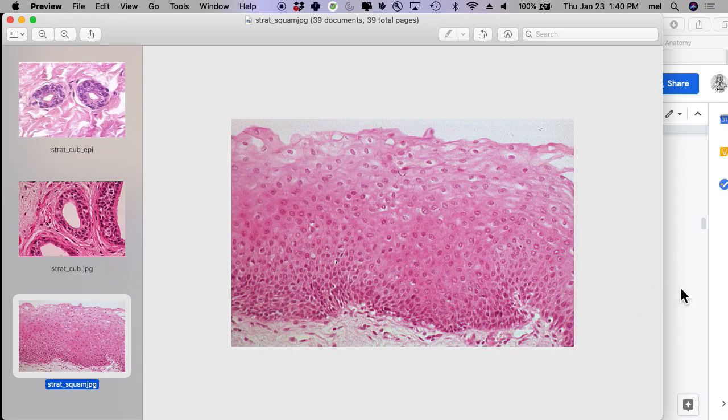The second question is what everybody expects, which is what is the specific tissue? And what is this one? Stratified squamous, be more specific. Moist or non-keratinized stratified squamous epithelium. Everybody expects that question, and a lot of students never go further than that. That's part of the reason that they hate histology, because they never actually figured out what they could be asked. But there are a lot more questions I can ask you out of this.